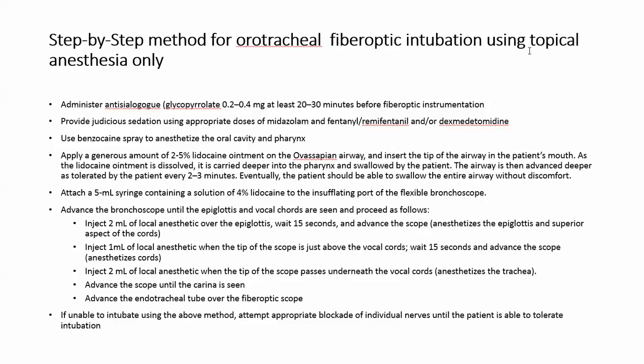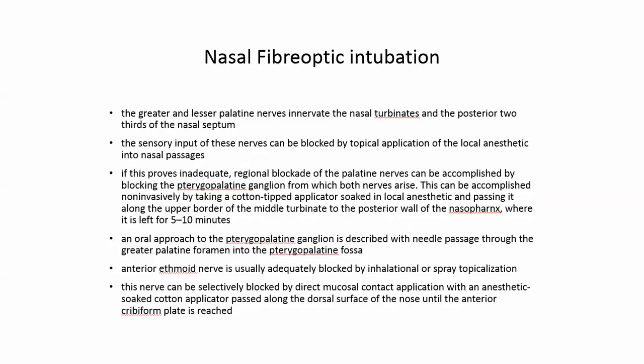If for any reason it is unable to intubate the patient using the topical method only, appropriate nerve blocks of individual nerves can be done to make the patient cooperative. The nasal fiber optic intubation.